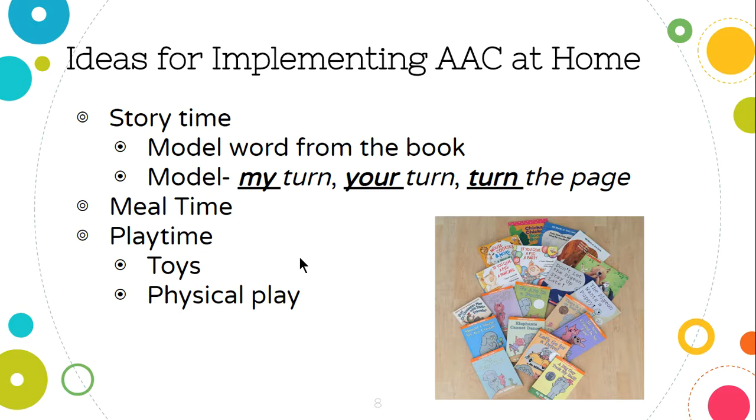During mealtime, you could request more of something. You could say, I don't like it, or I like it. You could talk about putting things on the table. You could talk about stopping something, maybe if they're doing something silly at dinner that they're not supposed to do. That's what happens a lot at my house. So those would be some things you could talk about there.